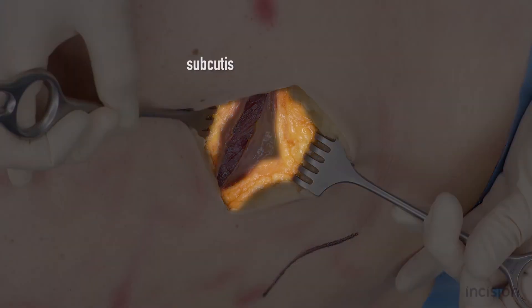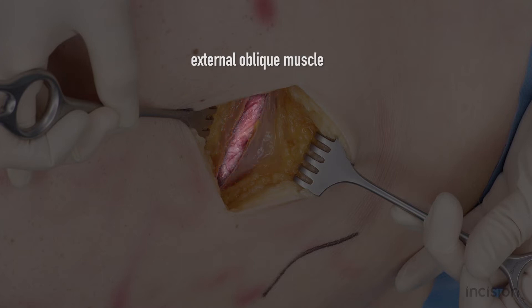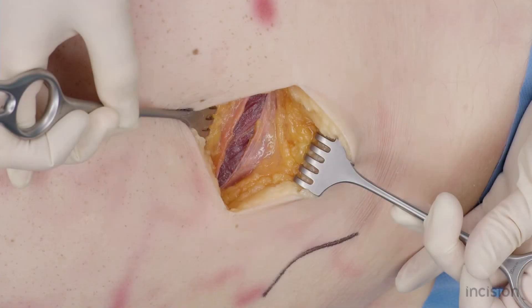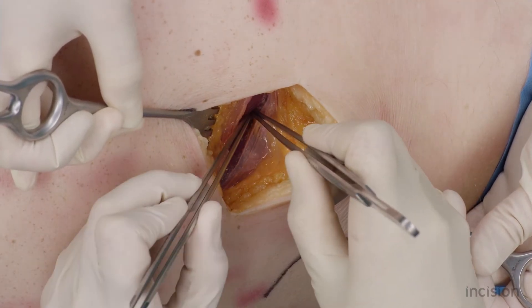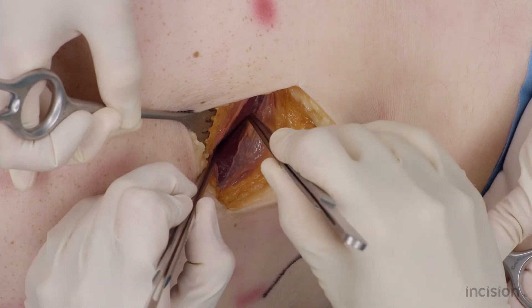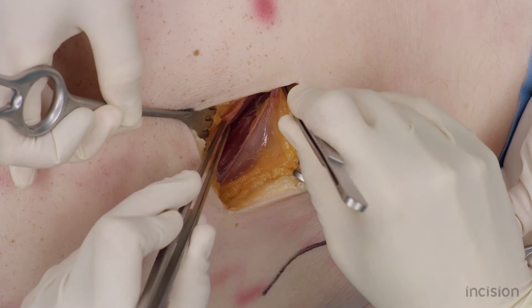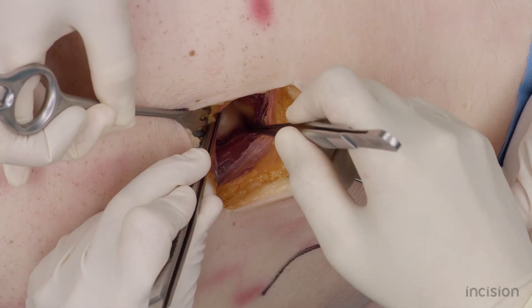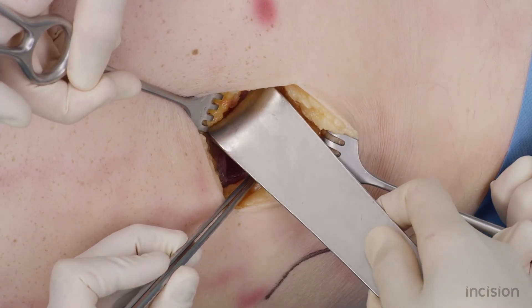The subcutaneous layer, the aponeurosis of the external oblique muscle, and the external oblique muscle are now visible. Split the external and underlying internal oblique muscles and transverse abdominal muscle parallel to its fibers with two dissection forceps. Hold the muscles aside with retractors.